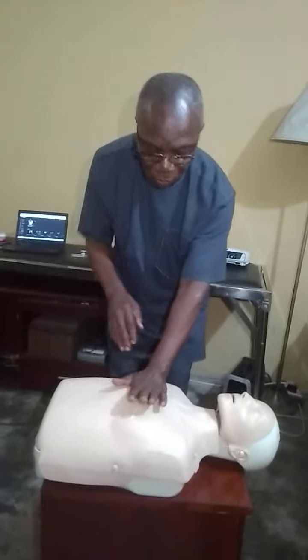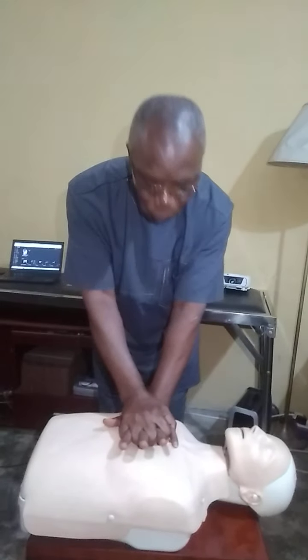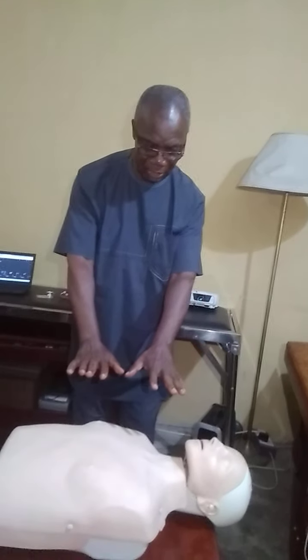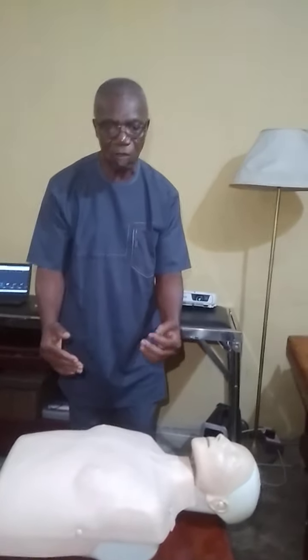So I will go on with the same process I've been going through until help arrives, or if there's a change. If there's any change in the state of the person, I can just simply put the person in a comfortable position until the help arrives. That is CPR and the use of AED. Thank you very much.